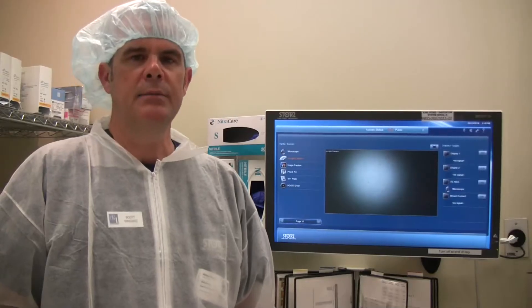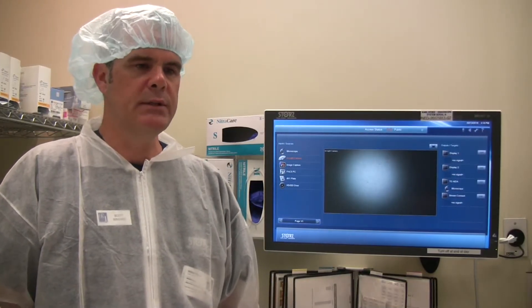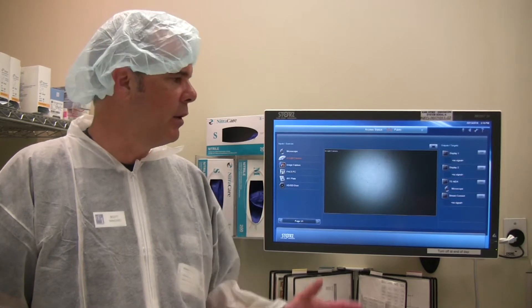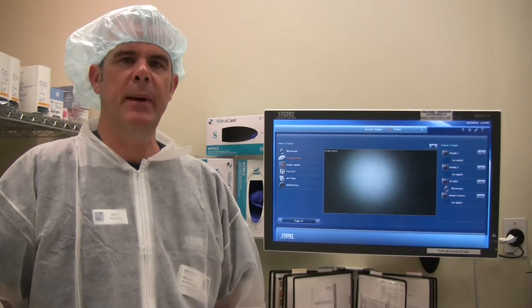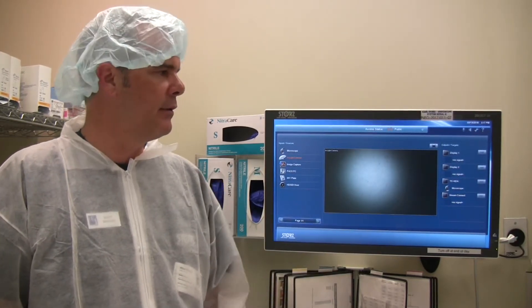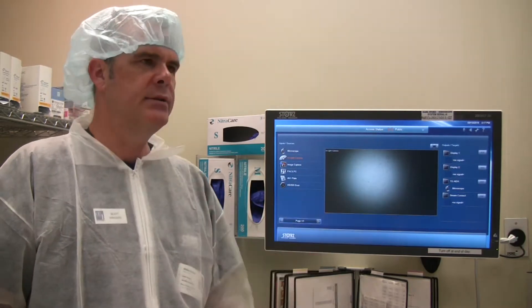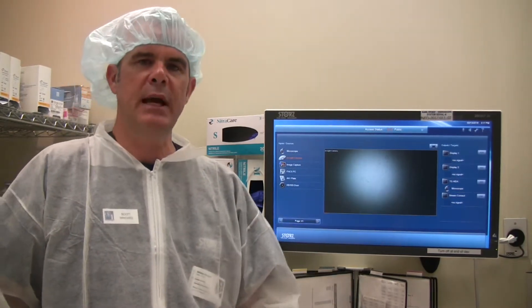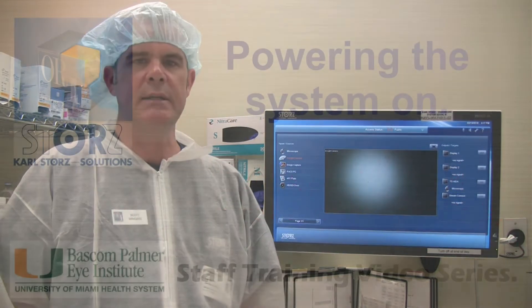Hi, I'm Scott Wingard, the OR1 sales engineer for Carl Storz, and today we're going to go over the integration systems at Bascom Palmer Eye Institute. I'm going to cover the logic of the touch panels as well as the image capture devices in each one of the rooms in detail.